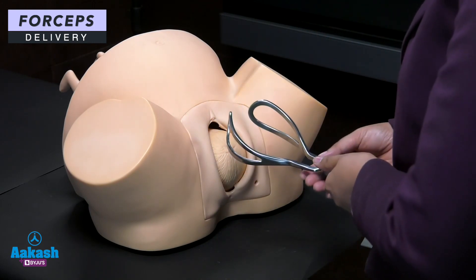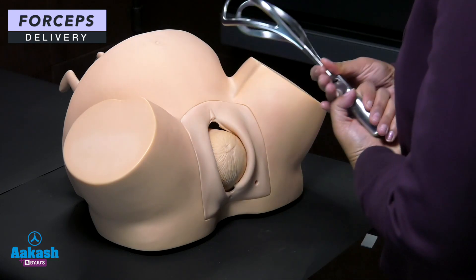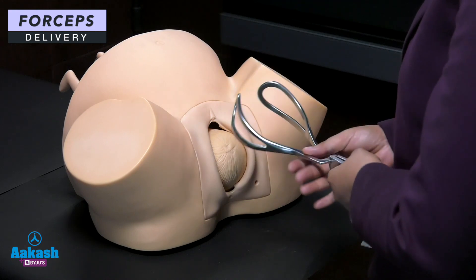Important: you have to hold the blades correctly. The pelvic curve should face upwards — not downwards. So the pelvic curve should always be upwards.